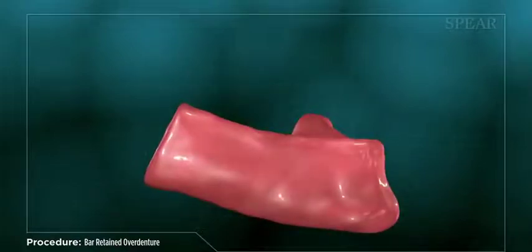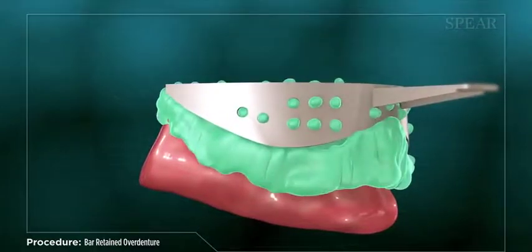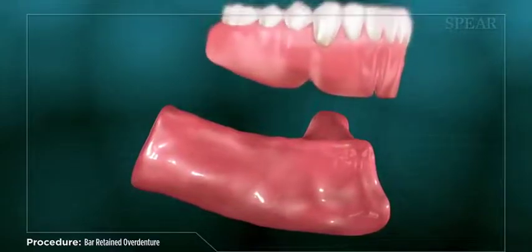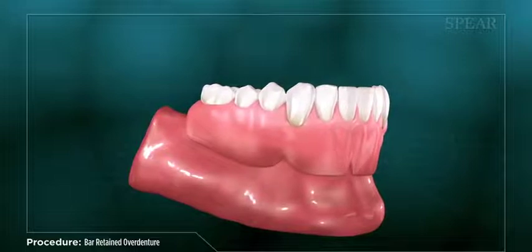The first step in this process is to take an impression of the area, which your doctor will use to create a set of temporary dentures for you. When the temporary dentures are completed, diagnostic images are taken of the area to plan out the placement of your dental implants.